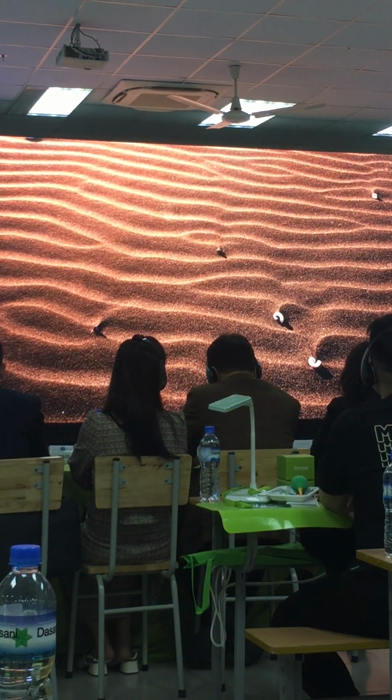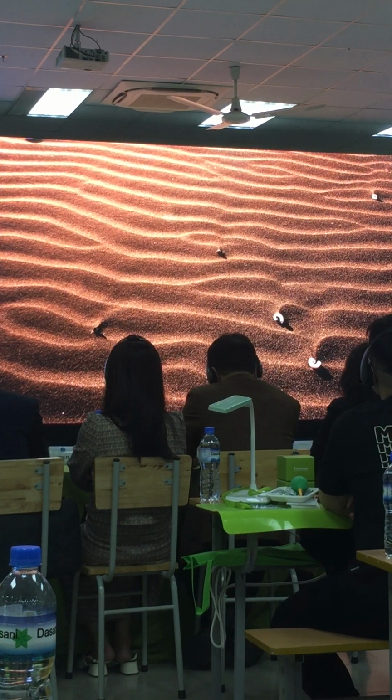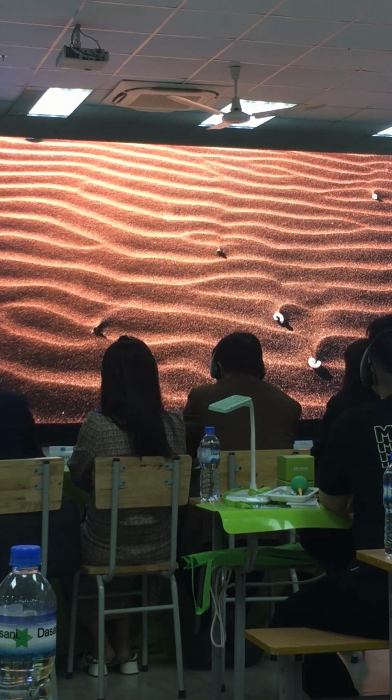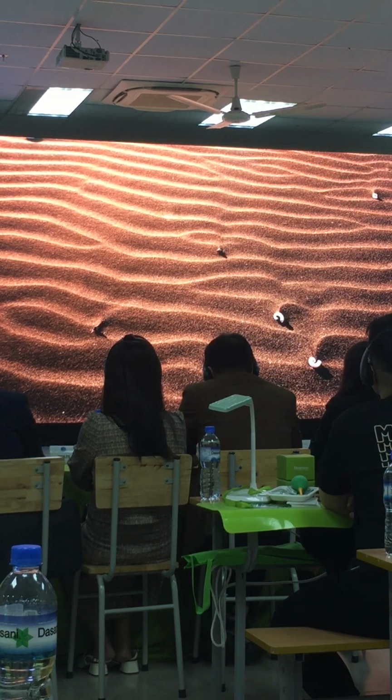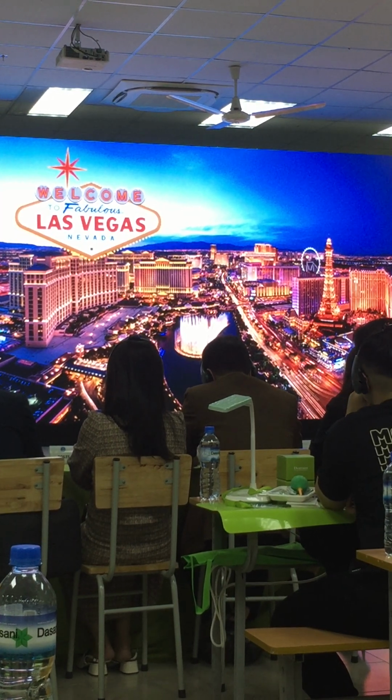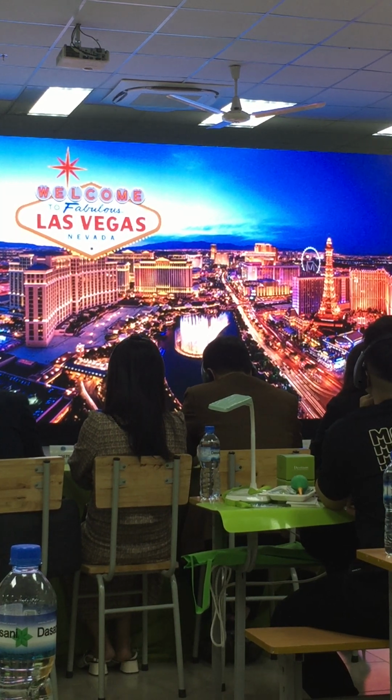The desert has barren soil and a lack of living creatures. As a matter of fact, the posterior maxillary region in our jaw is similar to a desert in many ways: poor bone quality containing just fatty marrow, and a lack of bone quantity. Today's topic is how we could make an oasis in the poor posterior maxilla so as to place dental implants.